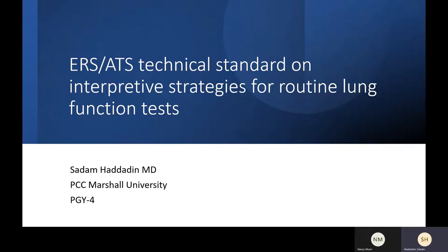The clear ones are clear. Somebody 50 years old comes to you with FEV1 of 30%. If you say 30% or you take it to the Z-score, it's going to be severe disease, very clear. Our problem is the young, where they're pushed to the left, or the elders, who are pushed to the right. Like this one, they put different ages from 8-year-old to 10-year-old. There's the percentile and the Z-score. The Z-score is only mild, moderate, severe.